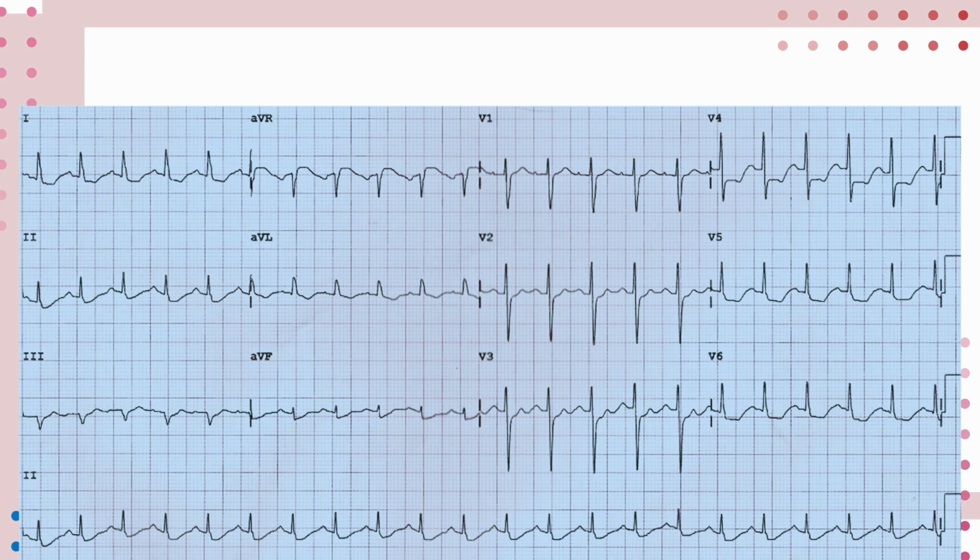I will definitely ask more questions. I'll say, oh, can I see the patient? Or are they doing fine? Because why? Ventricular fibrillation, for instance, is not compatible with someone who is alive. Ventricular fibrillation, you're either dead or about to die. So I know that ECG is probably false, and there might not actually be any need for me to start running around at that time.